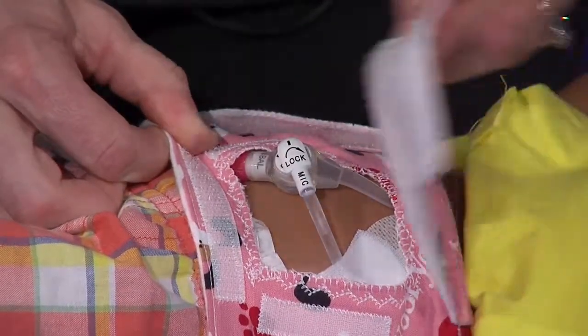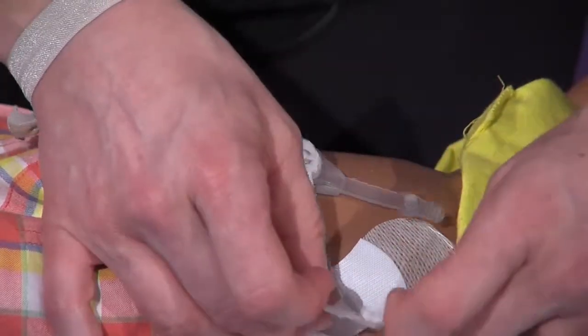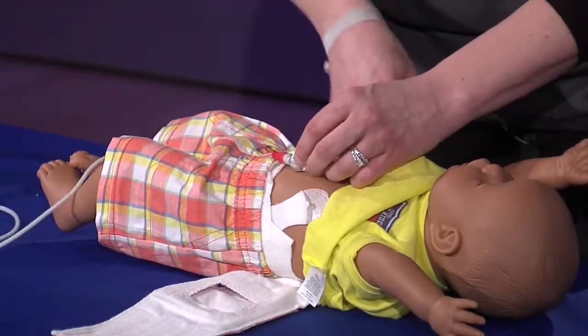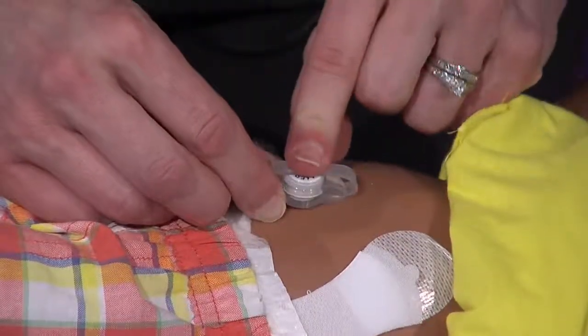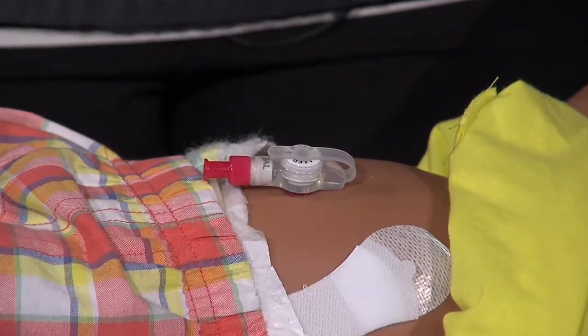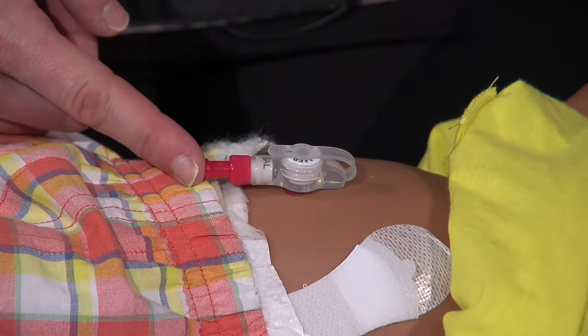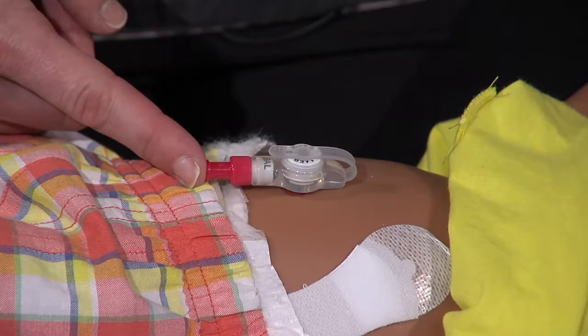It is also important to remember to remove the extension tubing when you are moving your child from one place to another to prevent it from accidentally being pulled out. Your child's tube may have tape or a red cap over the balloon port. This is a reminder not to use the balloon port unless instructed to by your child's healthcare provider.